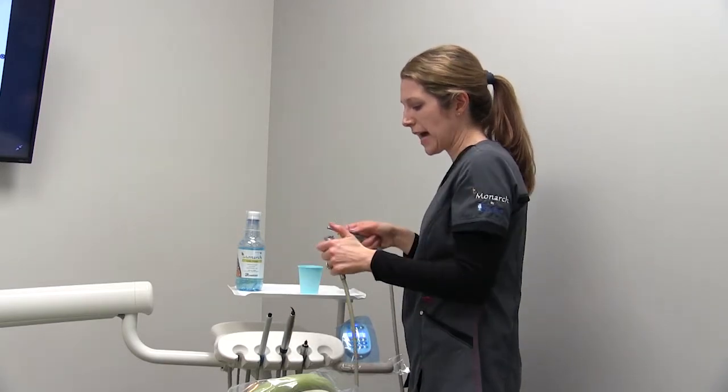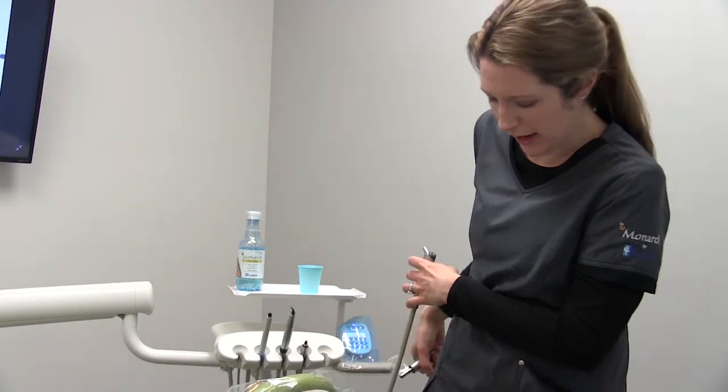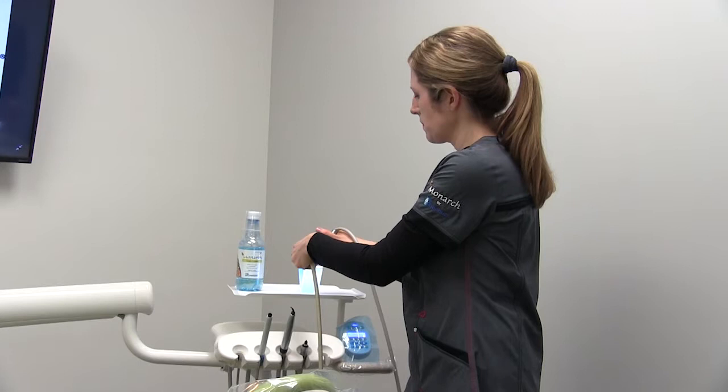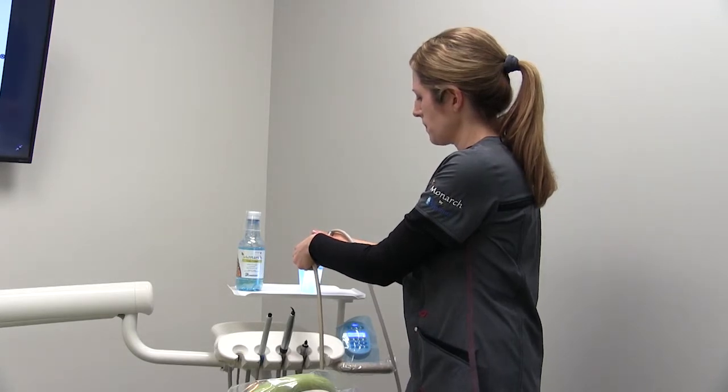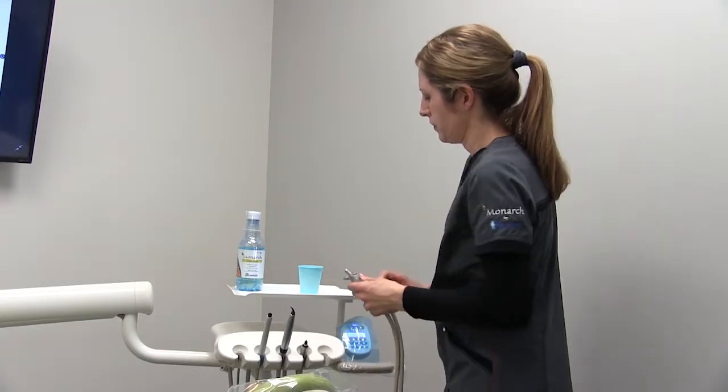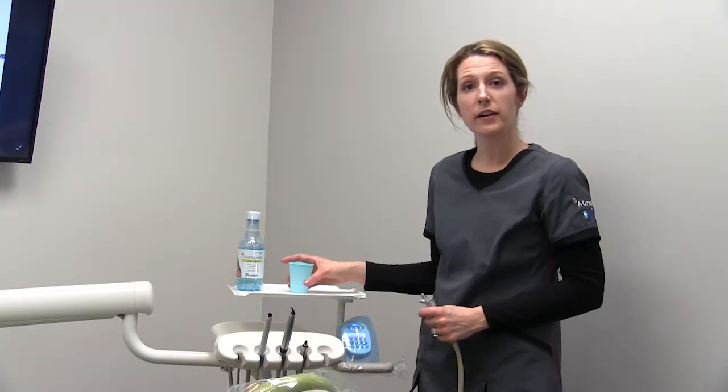When you start to see the product stop, make sure your water is turned on on your handpieces, and you're ready to go.